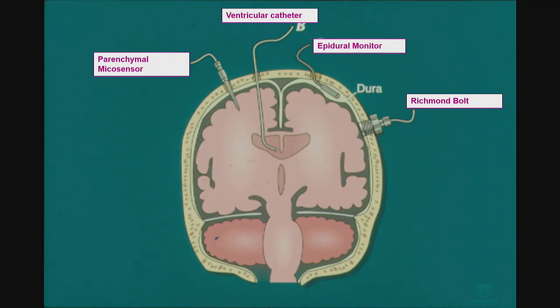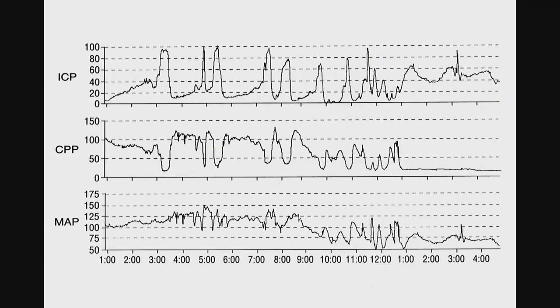But this is great, because the idea is the intracranial pressure can go up, and we can see that ICP surge to 30 or 40, and we can give our bolus osmotherapy, hyperventilate, or do what we have to do, right? And try to prevent the neuroworsening event. Try to prevent the pupil that's gonna blow in after about an hour of an ICP of 30 or 40. So this is what plateau waves look like if you haven't seen them. These are the world's worst kind of plateau waves you can have.